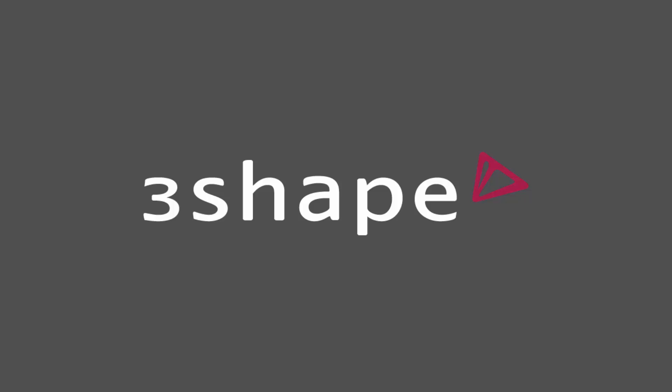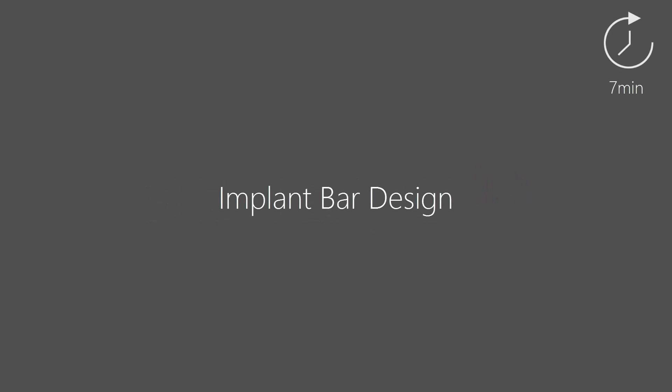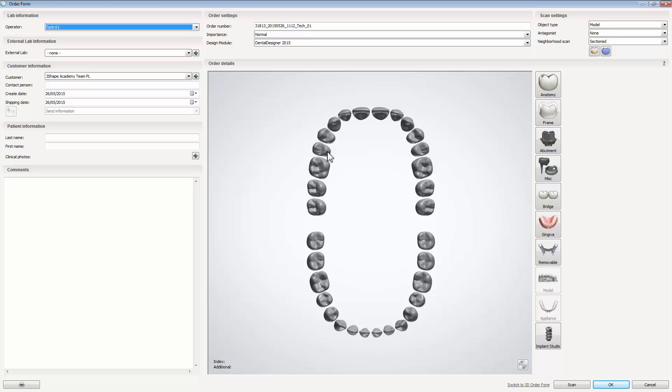In this video we will show you how to design the implant bar framework. Start with creating a new order for the implant bar.